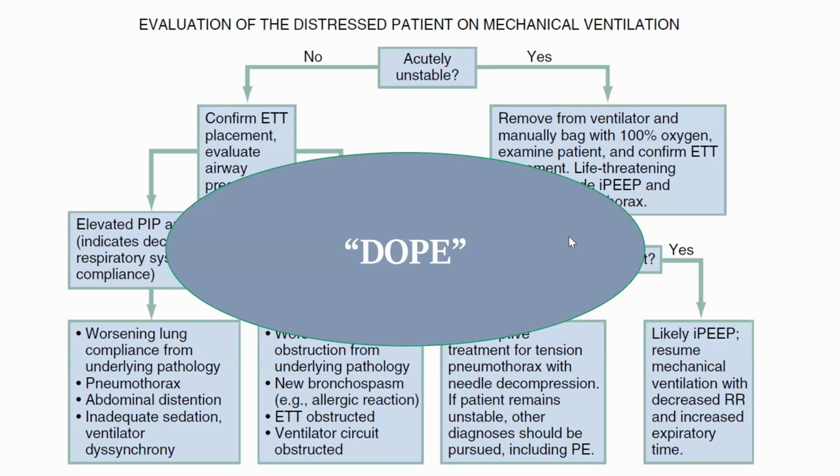But if you set the PEEP, for example, at 8, it only has to come down a few units below 10 to trigger a breath. So it will be easier for a patient to trigger a breath if you set a higher PEEP. Whenever a patient develops auto PEEP, you need to increase the PEEP to resolve it, not decrease it. Mostly practitioners tend to decrease the PEEP. You don't decrease the PEEP to troubleshoot auto PEEP; you rather increase the PEEP. Okay, I think you have got the idea.